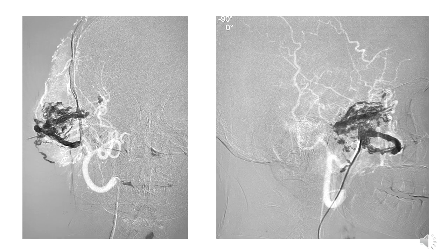Once we know how the runoff is there with the direct puncture, we can progress to inject glue, which is in my practice 20% N-butyl cyanoacrylate mixed with lipiodol, but sometimes it varies from 15% till 50%. Occasionally I also inject 100% glue to knock off some vessels, which is internal ligation, or if there is a high flow shunt in the tumor, or if I'm dealing with a very high flow craniofacial malformation.